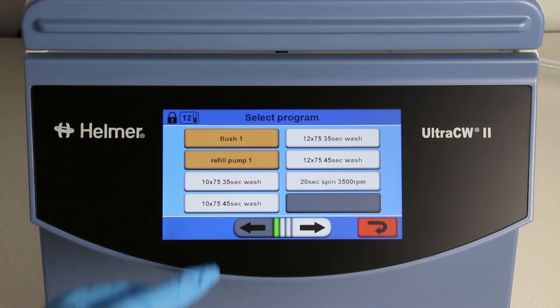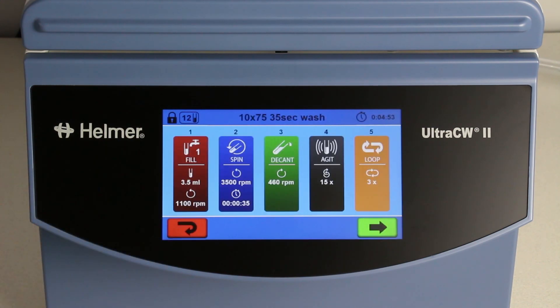Let's review one of the pre-set wash programs as an example. The first four processes are fill, spin, decant, and agitate. Next, there is a loop step. In this example, the loop is set to 3, which means the processes prior to the loop step will run a total of 3 times.